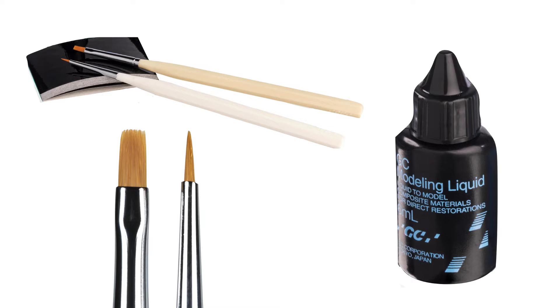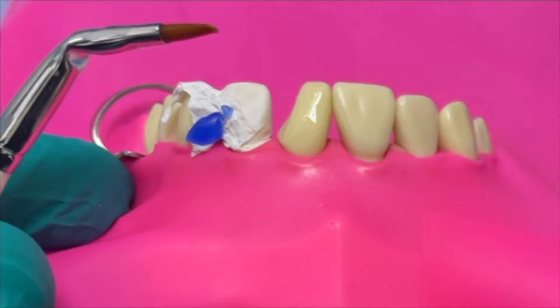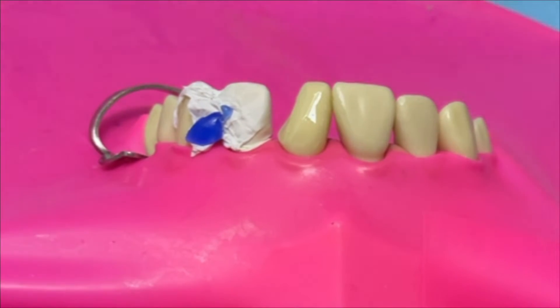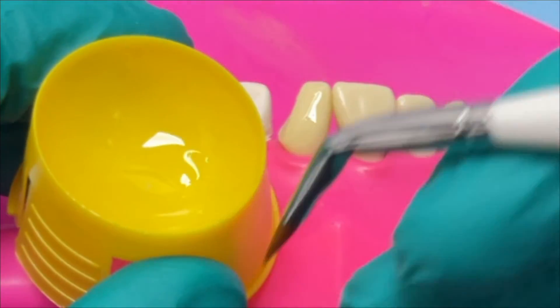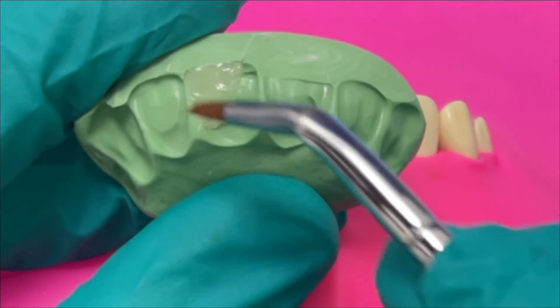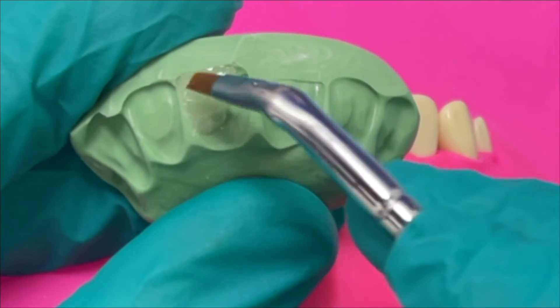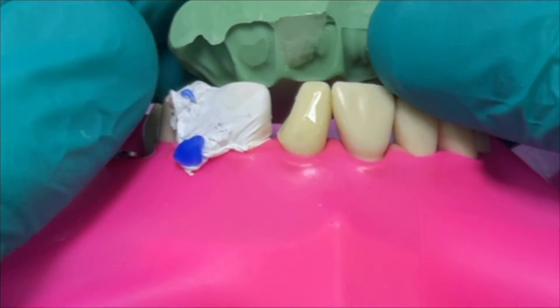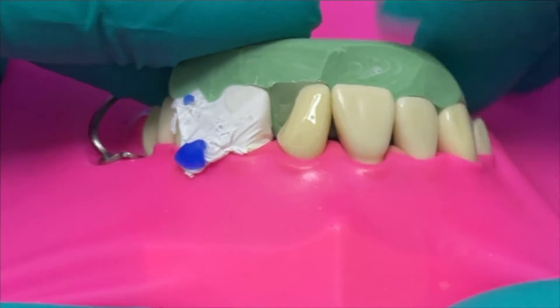Other products I'll use at this point are the GC modelling liquid, which can wet the instrument, and also the GC brushes. I like the flat brush - there are a couple available and I like to put a little bend angle on them, I find them much easier to use that way, especially posteriorly. I'll put a little drop of modelling liquid into a dappens dish, and then you can smooth and adapt that enamel layer of composite. We're going to use the brush throughout the layering process. Once that enamel layer is done and nice and thin, we press the putty against the bonded tooth and simply light cure.